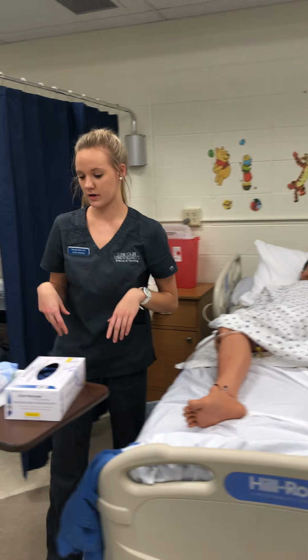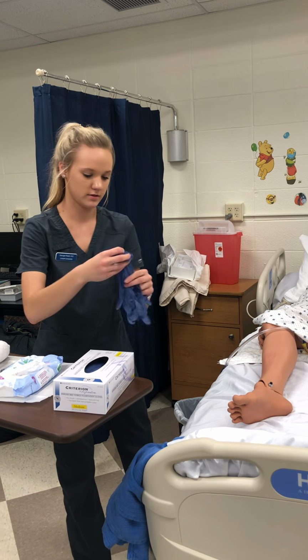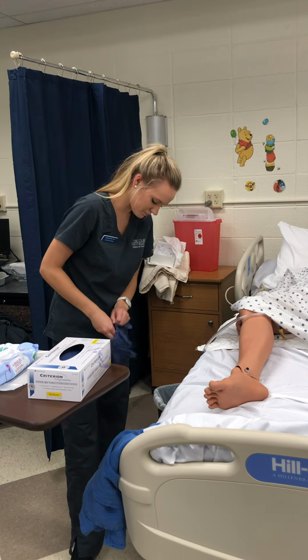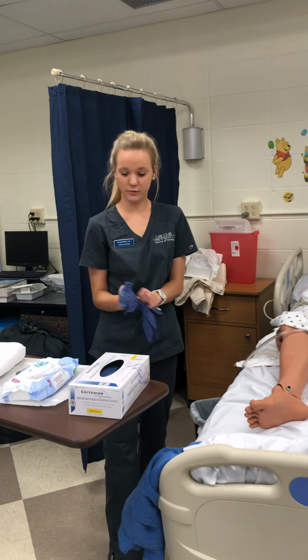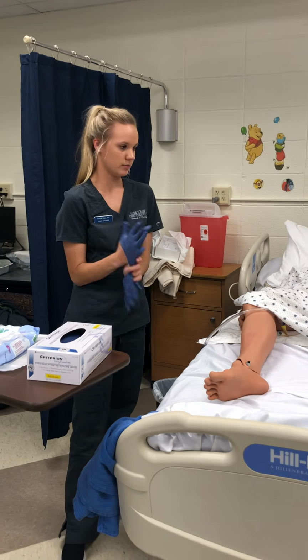Perfect. Okay. I'm gonna go ahead and get my clean gloves on. I wanna make sure that I bring an empty syringe with me, and I have one right here, which is good, to deflate the balloon.